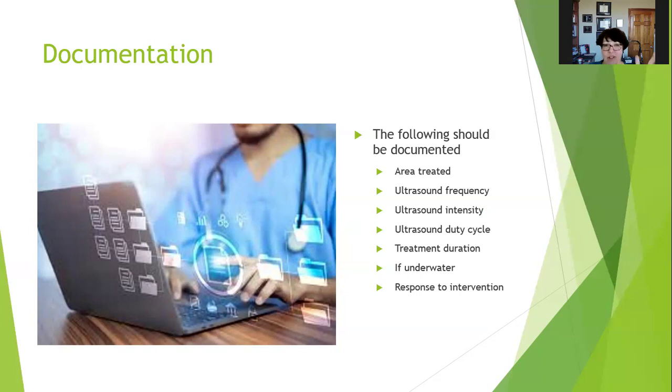But document that, and then the next time you go around, the other thing, of course, you always want to document is why you did it. So you did ultrasound for deep tissue heating. You did ultrasound to increase circulation and accelerate healing. And whatever the reasons were that you did it, you're going to document that as well.